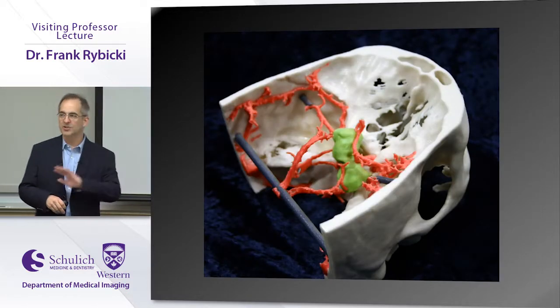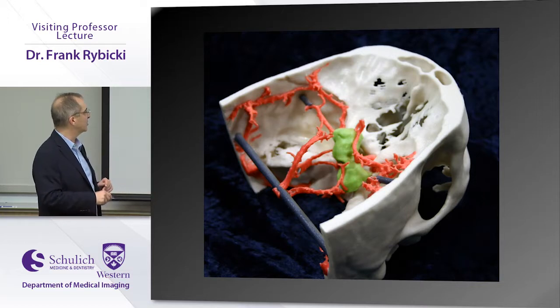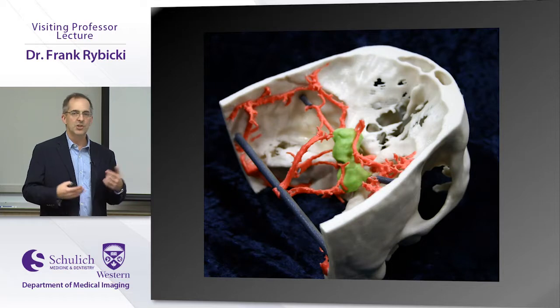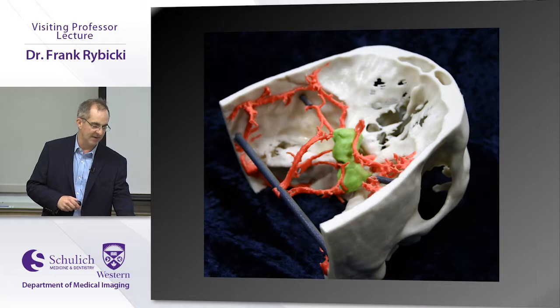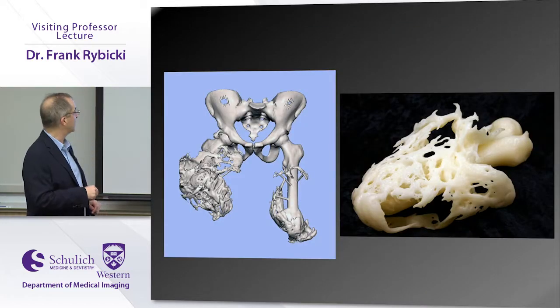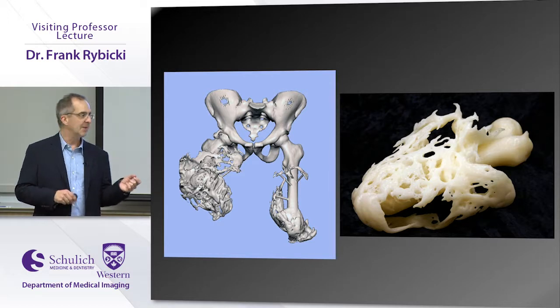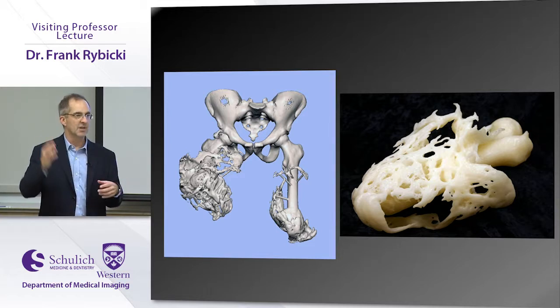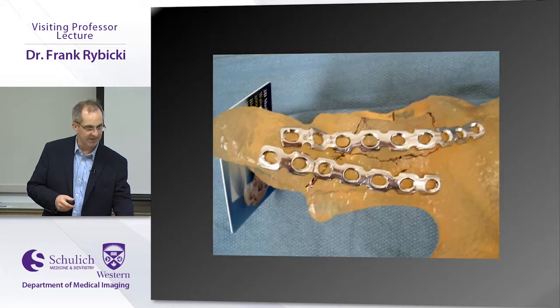All complex skull-based surgeries are now 3D printed. Like, you will not get away with doing a complex aneurysm, or no surgeon will touch this case until it's 3D printed. And you can actually set it up with vasculature. You can make blood flow through it. You can actually print it in multiple different materials, and no one will touch a case without a model at this point. Heterotopic ossification is another thing, like complex fractures, complex heterotopic ossification, where they're going to go after this. They always make a model first now, and they cut into it, and they will actually do the surgery at the dry bench before they actually go after that type of complex case.